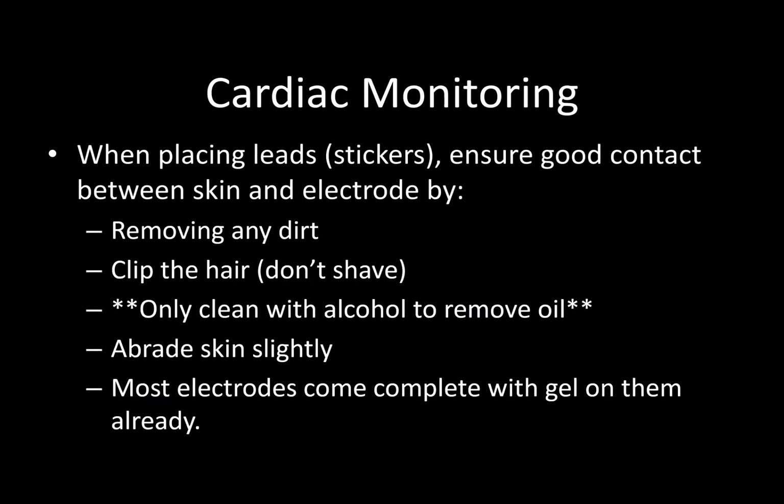All right, so I am taking the time right now to say this because it is the absolute foundation of being able to read ECGs and EKGs. You have to put the stickers, the leads, on correctly and well in order to get a good signal. Otherwise, it's like trying to watch a high resolution video on your mobile device when you've got a bad Wi-Fi connection. You're going to be skipping all over the place. It's going to be blurry. It's just not going to work right.